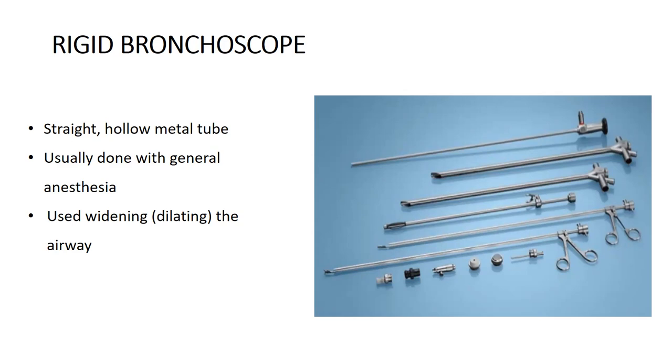You make the matters worse. Only in select patients of hemoptysis, where you can specifically locate the segmental or subsegmental bronchus where the bleeding is from and which is not suitable for other interventions, only then do you do a therapeutic procedure through bronchoscopy. Very limited scope. Have you understood, or do you have any questions?